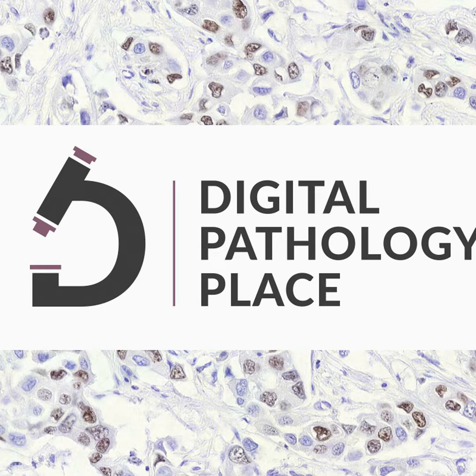All right, so the other study, the accuracy study, is the granddaddy study. In our case, it was 4 sites, 4 pathologists per site, over 2,000 cases. The basic design is that the pathologist looks at a case with microscopy, and then looks at the same case with digital after a washout, or vice versa. They're randomized, put in smaller groups, and mixed up. If you add all of that up, I think it's about 15,000 diagnoses. So 15,000 instances where a reader looks at a case and says, yes, it's basal cell carcinoma, or it's a hernia sac, or whatever.